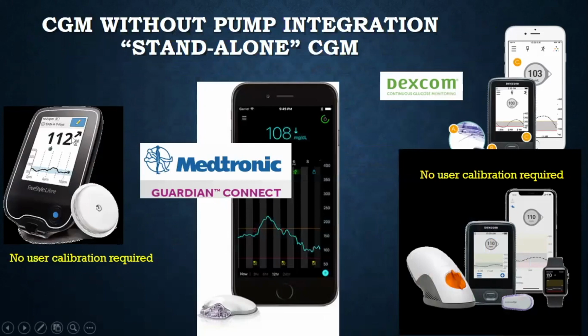This meter does not alert the patient if there's a low blood sugar or if it's heading towards a low blood sugar or a high blood sugar. So this one must be flashed over the sensor. You have to physically put the little reader over the sensor on the back of the arm in order to get the information. It does not continuously alert a patient.